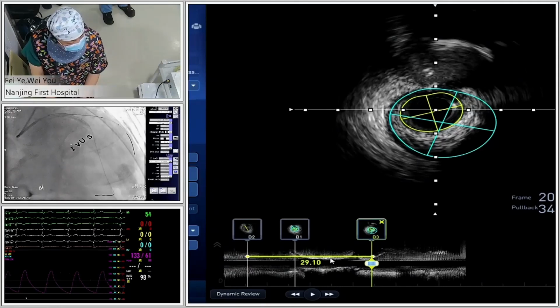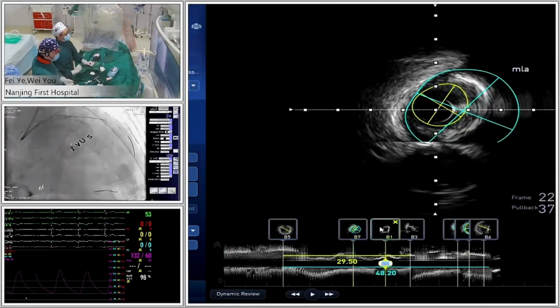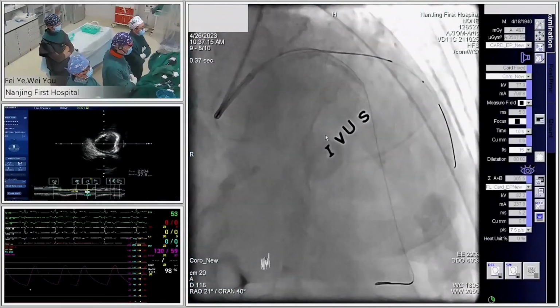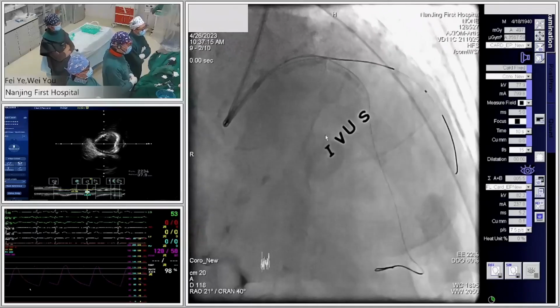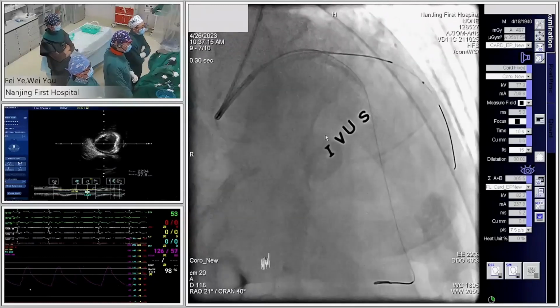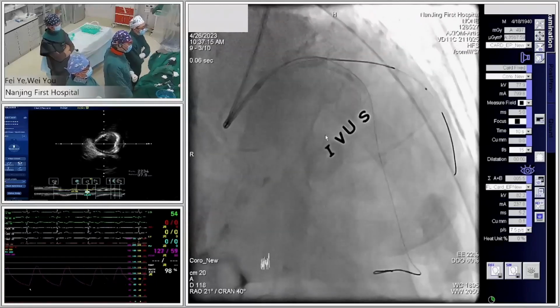Thank you, Dr. Pan, for giving us a very clear IVUS image result. And as you see, we calculate this patient's IVUS calcium score is nearly 2. So the indication for atherectomy may be good. But here in China, we don't have the orbital atherectomy. We just calculate the minimal diameter for the most severe stenosis is more than 2. So rotational atherectomy is not good.